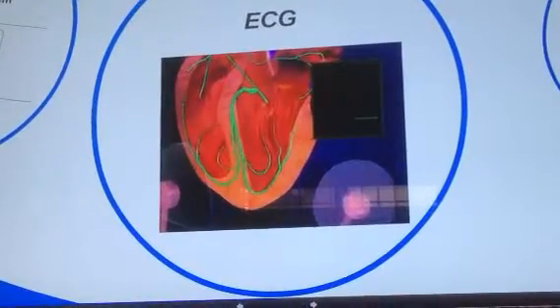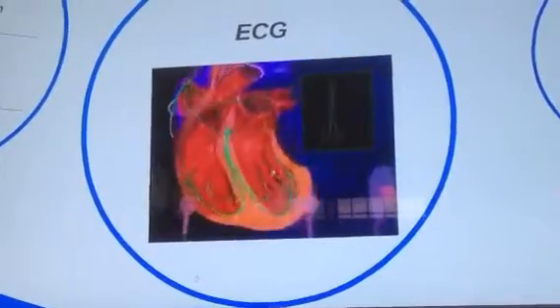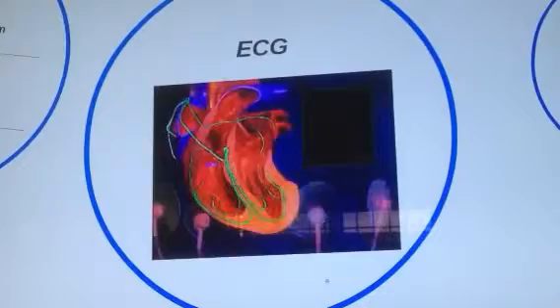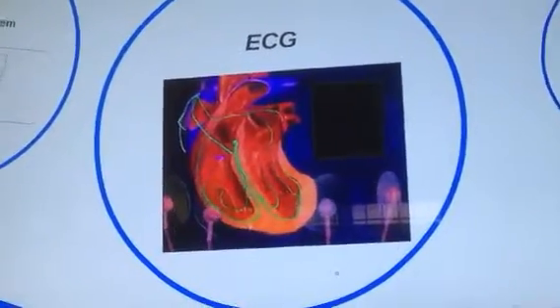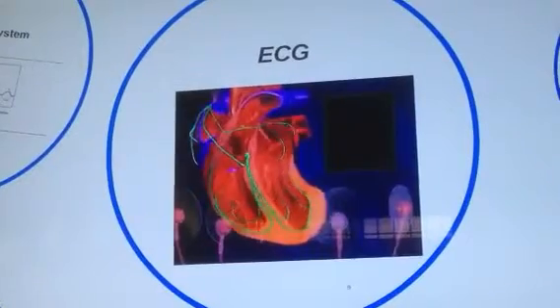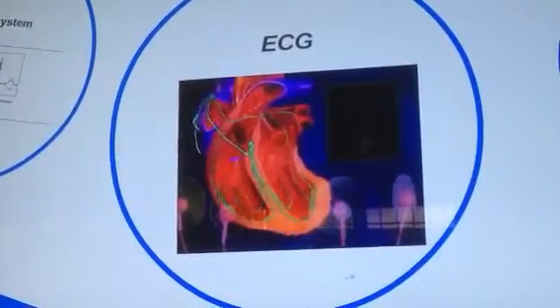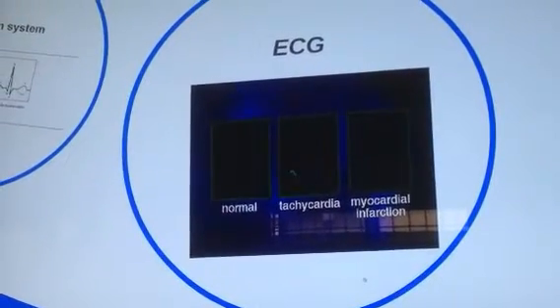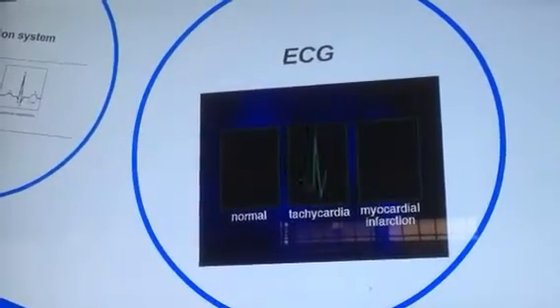Variations from the normal electrical pattern may indicate damage to the heart due to a heart attack or heart disease. Often, a patient will be required to perform a stress test during an ECG. A stress test usually involves walking or running on a treadmill at progressively increasing intensity while recording an ECG. This test allows the doctor to examine the heart's electrical activity during the stress of exercise.